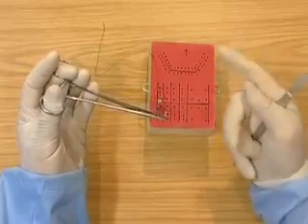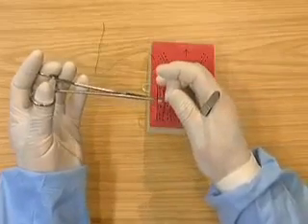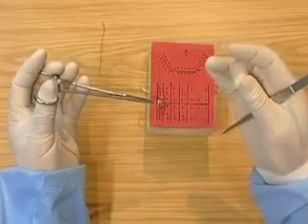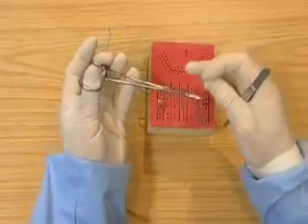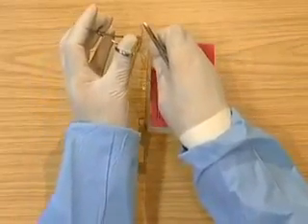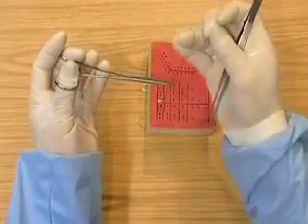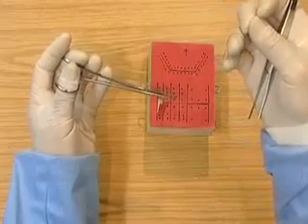Parking the tissue pickups. Passing the needle to the second finger and thumb, then going over and over with the needle holders. Picking up the end, winding on a little bit, and running the thread down.